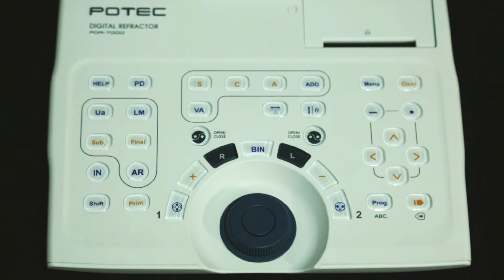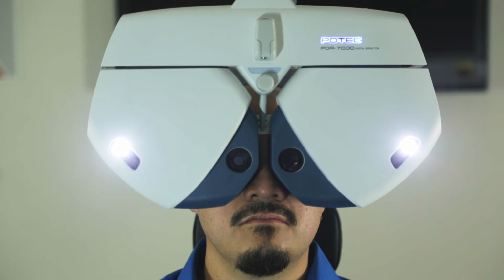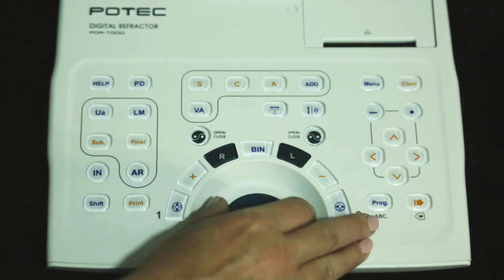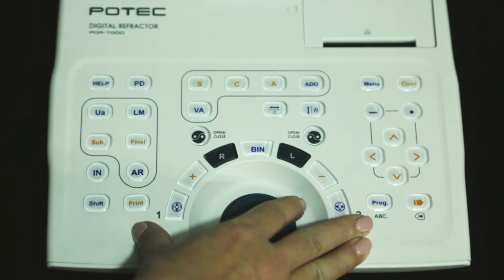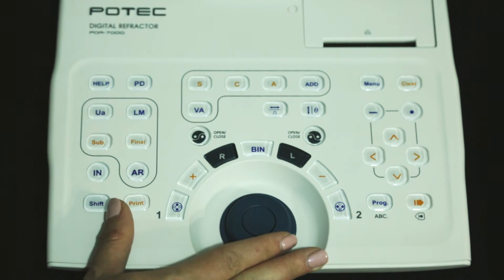Now we'll cover how to test for the add power. First thing you will do is press the add button. The banks on your digital refractor will converge and the lights will come on. Now here you can dial in your preset add based on your patient's age, and then begin your exam by pulling down your near point rod on your digital refractor and asking your patients to read the lowest line.